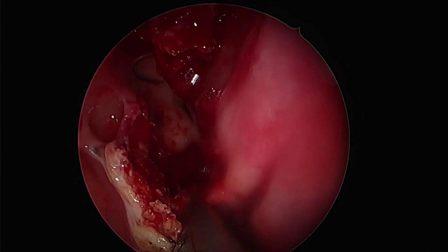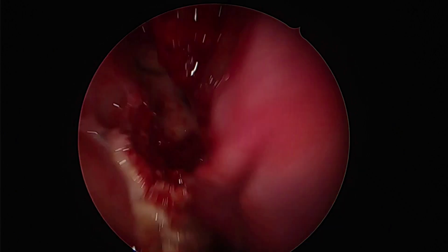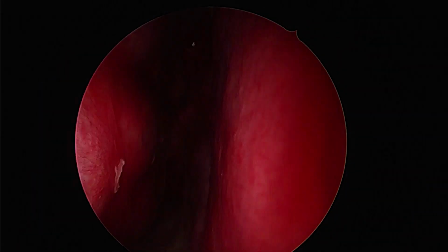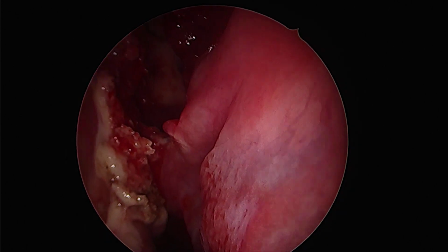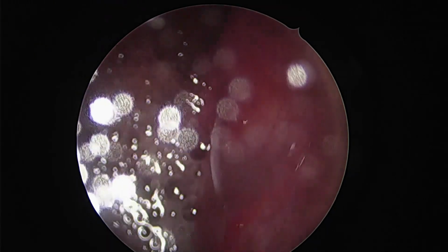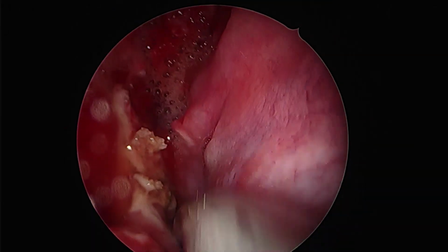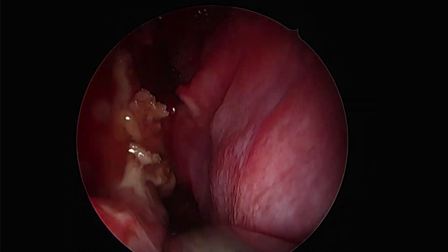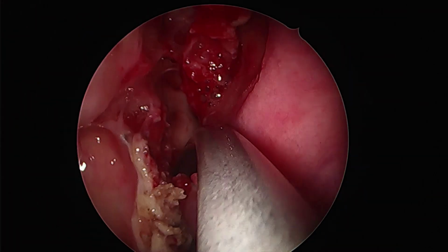We are probably reaching the bottom limit of our dissection. Any inferior, we will have to probably remove this septal flap or go through the septal artery, which would be unwise. Wherever possible, maintaining integrity of the septal vasculature is a good thing. One must try to preserve it. There seems to be no rationale in unnecessarily sacrificing the septal artery.